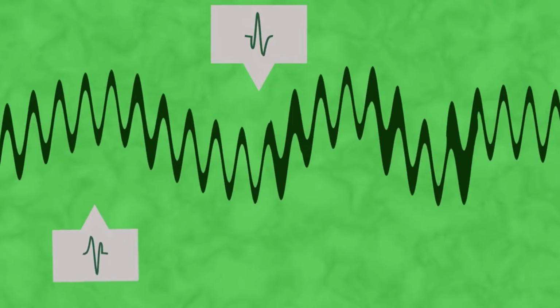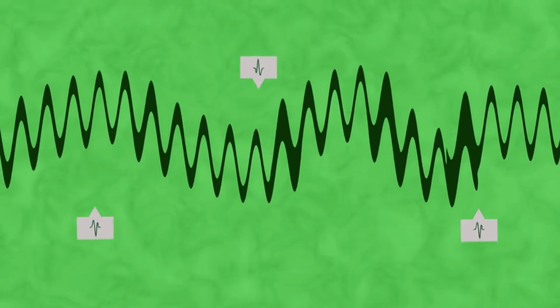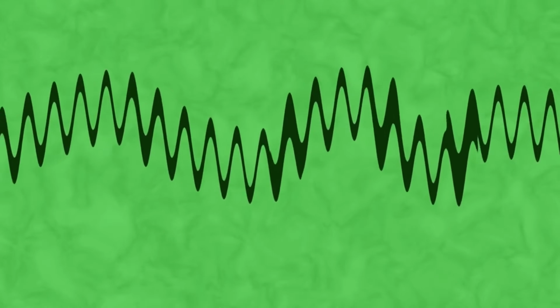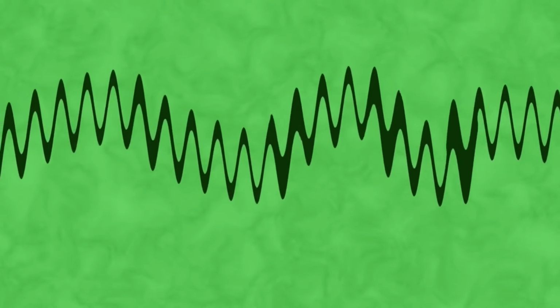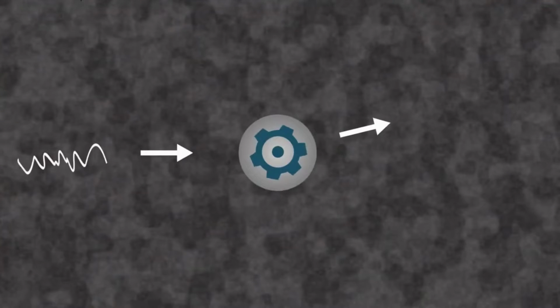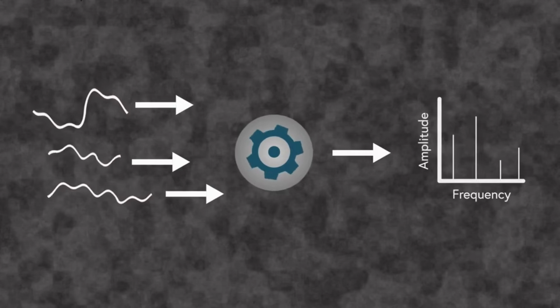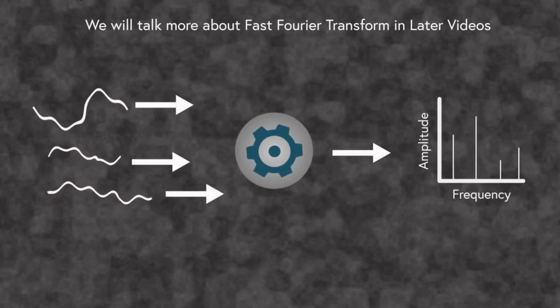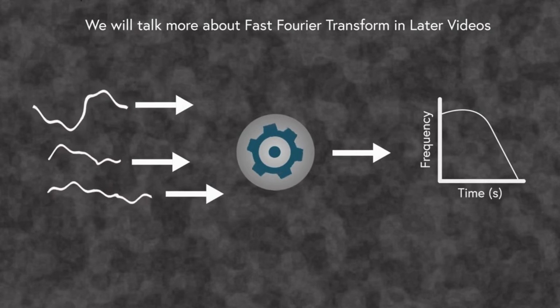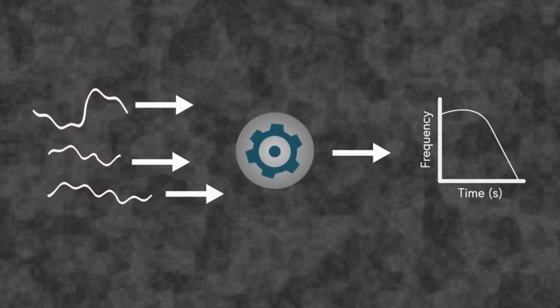But we aren't finished yet. The raw EMG signal we have is a mess of a bunch of muscle fiber action potentials jumbled together in the graph, along with contaminations of the signal due to uncontrollable motions, or in some cases, electrode placements which are slightly off. These contaminants are what are called noise. Using some fancy algorithms, the EMG signals can be decomposed into their individual action potentials. But that's not all. Researchers can use computational algorithms such as fast Fourier transform to track the frequency change in muscle contraction, which is very useful for figuring out things such as the strength and speed of muscle contraction, as well as when the muscle begins to fatigue.